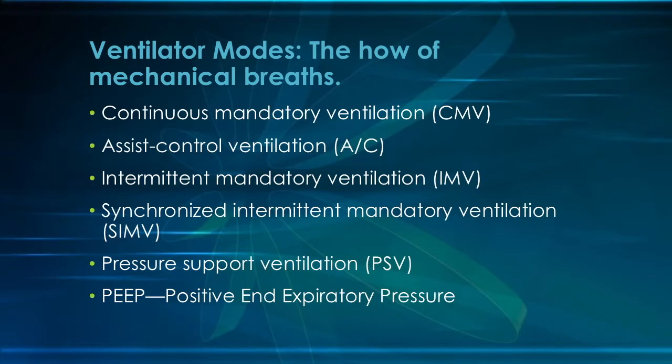But PEEP does increase thoracic pressure. If you have that increase in thoracic pressure, this could also lead to a decrease in your preload. Think about all that pressure in your thoracic cage. It's going to start to lean against your cardiac vessels, your pulmonary and cardiac vessels, and that could decrease your preload. So PEEP can actually decrease preload, which decreases our blood pressure, which decreases our cardiac output. So we really want to watch out for that.